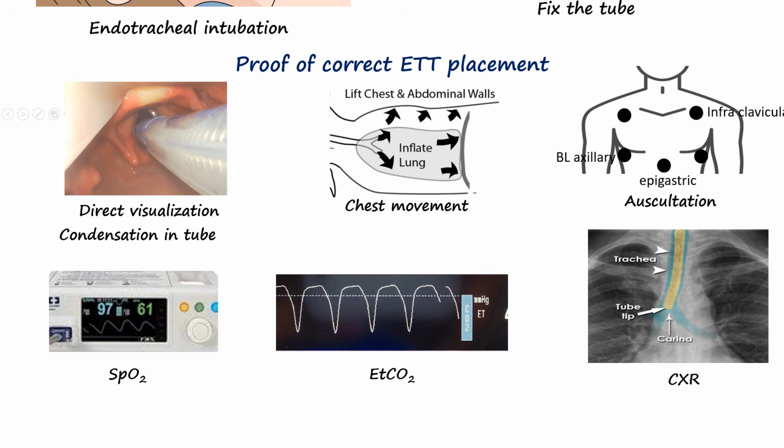There will be rise and fall of the reservoir bag if the patient starts breathing, if we are using a Bain circuit or circle system in open position. Continuous ET-CO2 monitoring remains the gold standard for real-time confirmation in both operative and emergency settings.